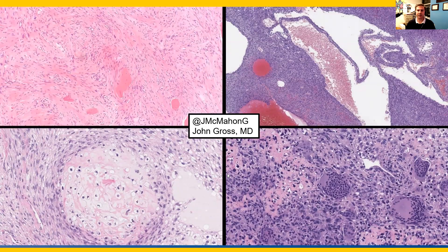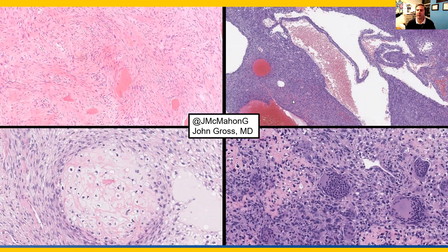Here is a collage of osteosarcoma subtypes. The top left shows a relatively bland, variably pleomorphic spindle cell sarcoma associated with a more well-formed bone — this is an example of fibroblastic osteosarcoma. The top right is an example of telangiectatic osteosarcoma with blood-filled cystic spaces and variably cellular and pleomorphic spindle cell sarcoma with large areas with fibrous septae. The amount of osteoid in telangiectatic osteosarcoma may be quite focal.